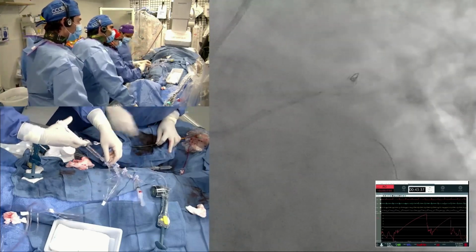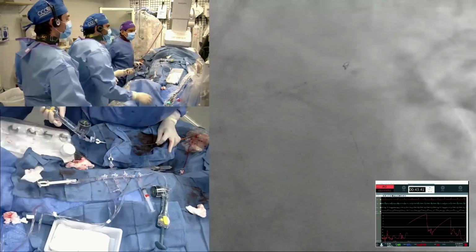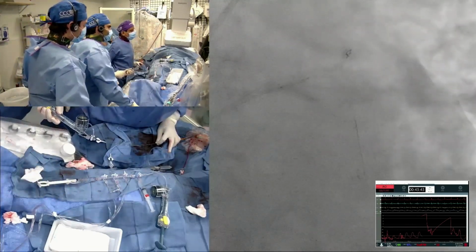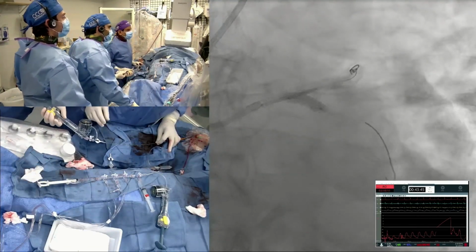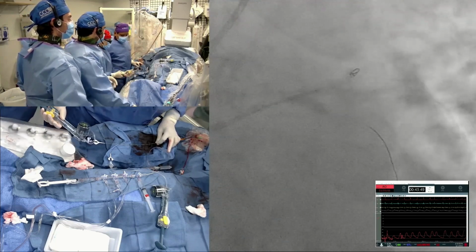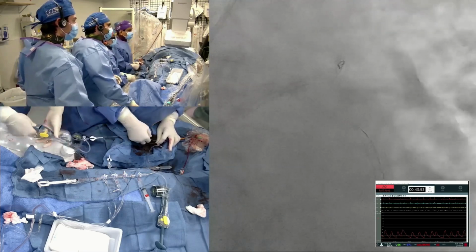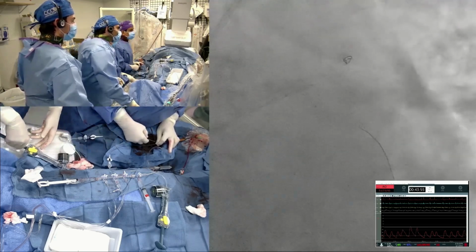Yeah. Any other comment? I see Dr. Sharma ready for a mini crush or a T-stent type bifurcation. Should we have IVL irrespective of the post-rota IVUS? With the safety margin as good as it is, should we have just done IVL irrespective of the post-rota IVUS? I agree.